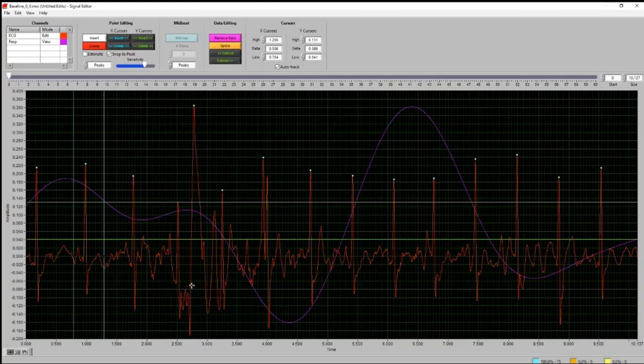So there are varying degrees of learning to edit the data, teaching other people how to edit the data, and then keeping everyone's edits consistent, so that inter-rater reliability. And you'll likely want to run an intra-class correlation coefficient once it's all said and done, especially if we have multiple raters. So with all of those things considered, you may edit the data differently, more aggressively or less aggressively, to keep things consistent between raters.